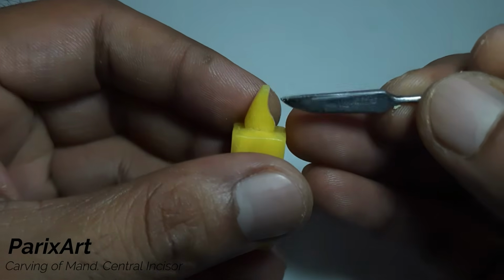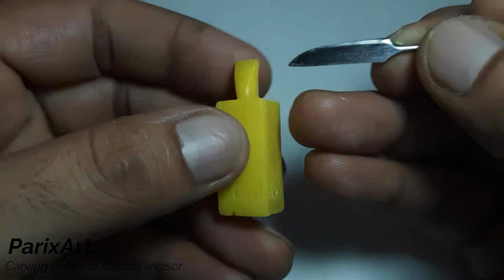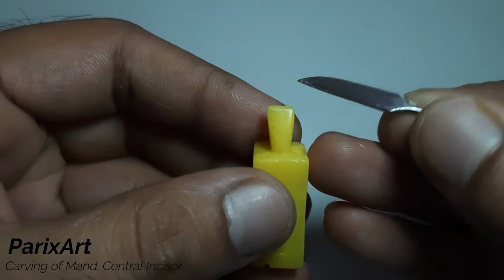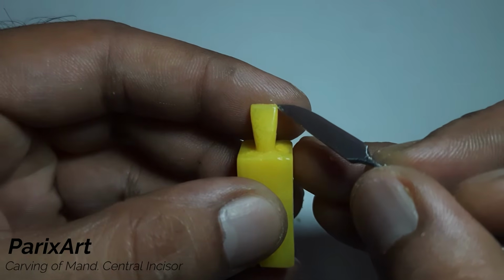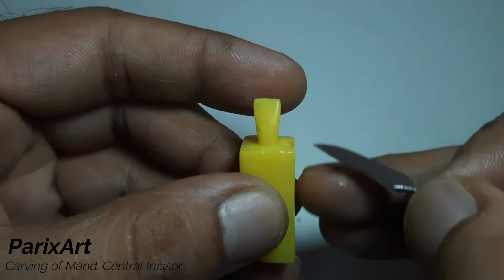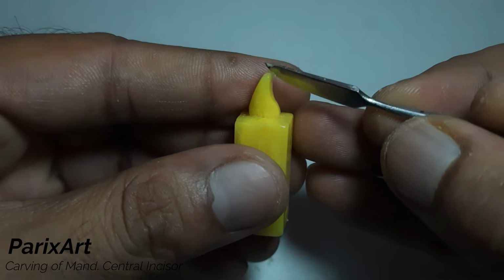Now we'll round off the incisal edge slightly. Also, we'll round off the disto-incisal angle very slightly. Just very slight, right? Now the incisal edge, very gently.